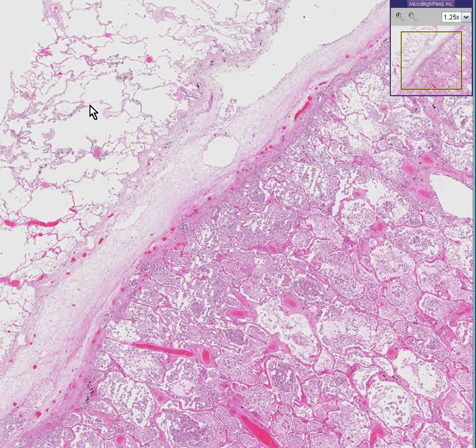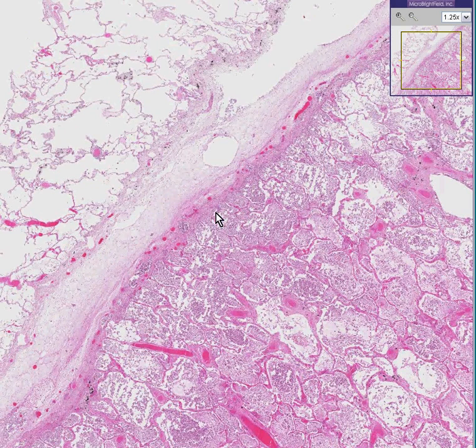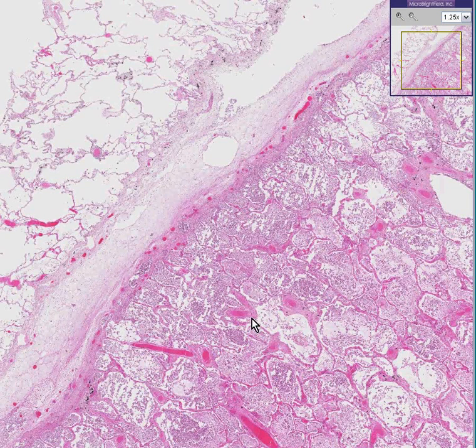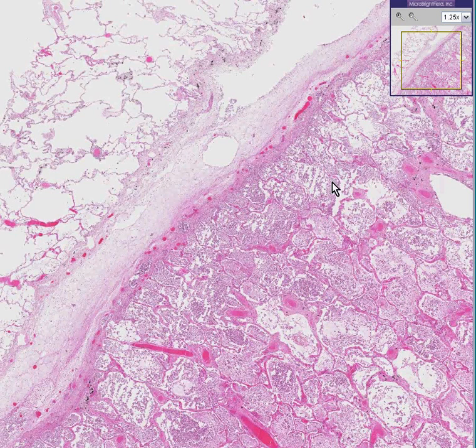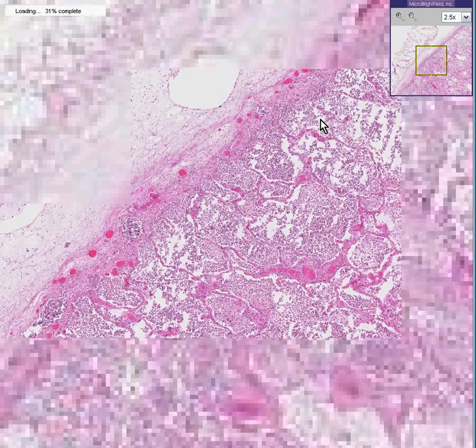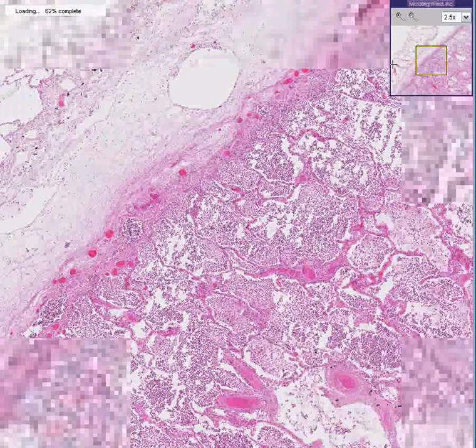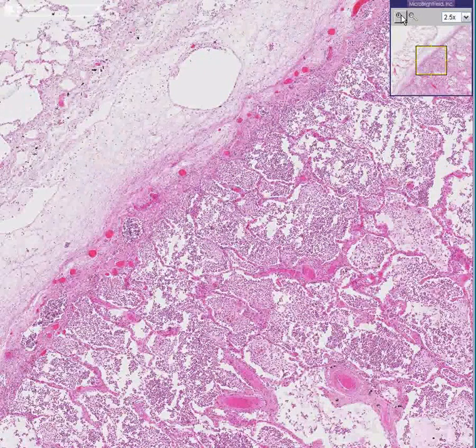Perhaps a little hyperemic — some of these blood vessels look a little more prominent than they should be. But in the southeast here, we have more than just prominence of blood vessels in the lung. We see that the alveoli are entirely filled with inflammatory cells, fluid, probably fibrin and junk, just like they are normally with pneumonias.